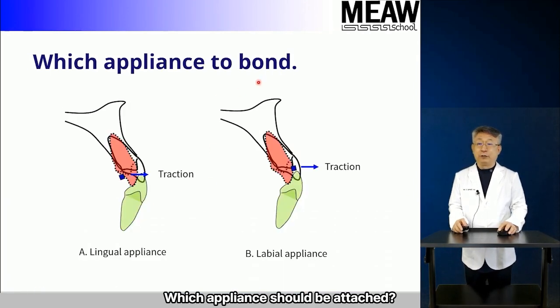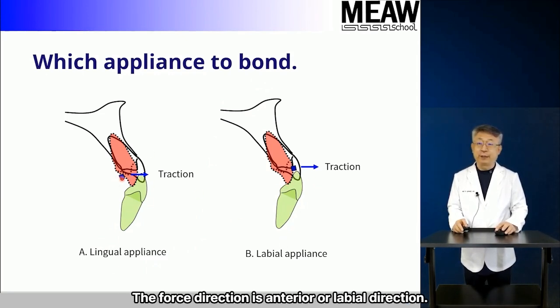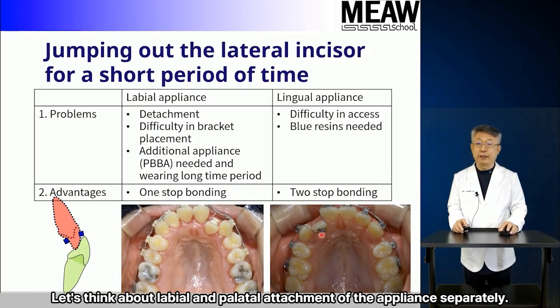Which appliance should be attached? It can be attached to either the palatal or labial side. The force direction is anterior or labial direction. Let's think about labial and palatal attachment of the appliance separately.